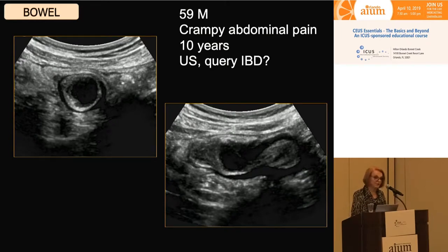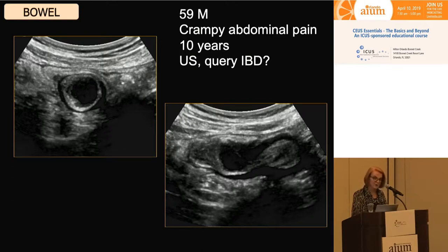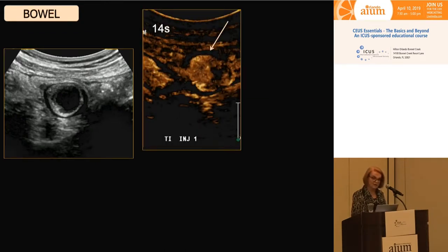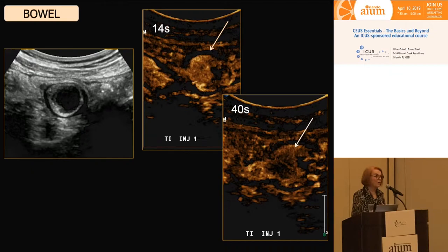Let's change gears now and look at a few cases of the bowel. This is a 59-year-old male who's had crampy abdominal pain for 10 years — the ultrasound requisition says query inflammatory bowel disease. He had two CT scans in the prior five years. When we look at this patient, we can see very easily a hypoechoic, very black mass related to the wall of the bowel. This doesn't look anything like inflammatory bowel disease — this looks like a mass in the bowel.